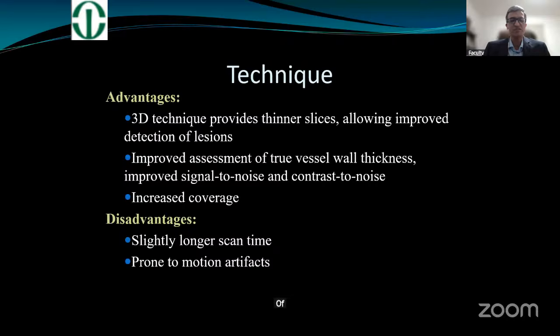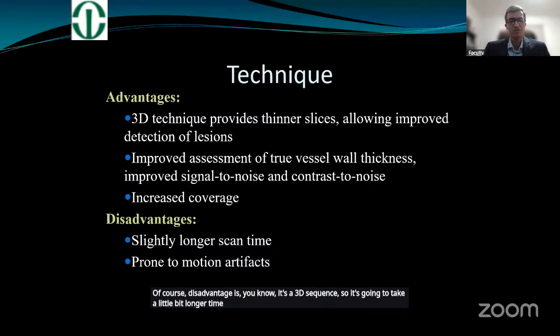Of course, the disadvantage is that it's a 3D sequence, so it's going to take a little bit longer compared to the 2D sequence. And of course, it's also prone to motion artifacts.